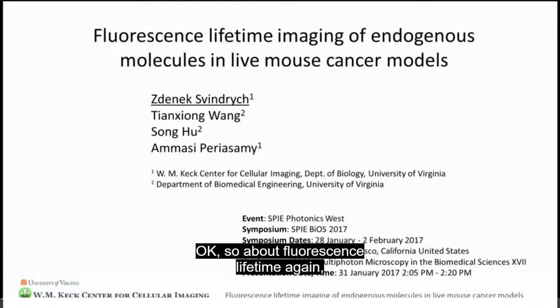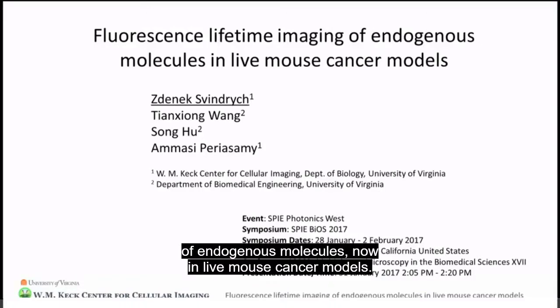Okay, so about fluorescence lifetime again of endogenous molecules, now in live mouse cancer models.